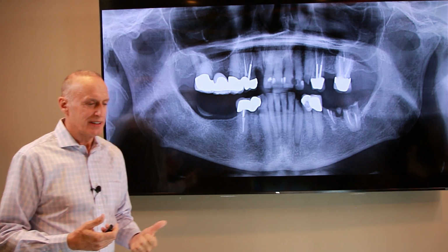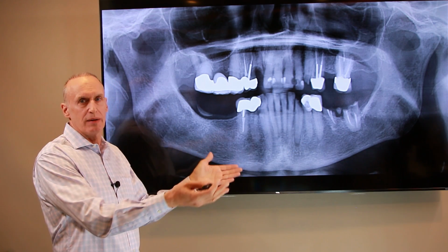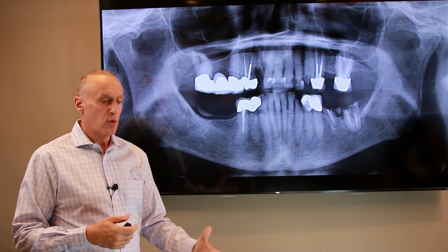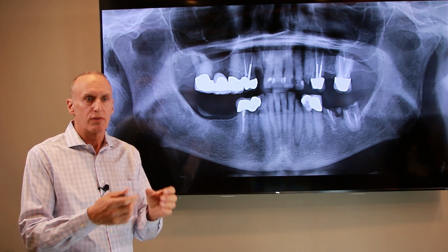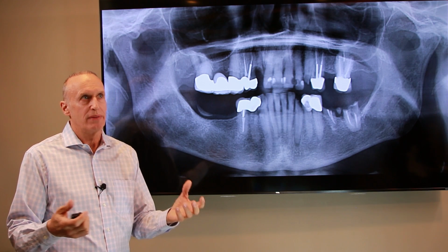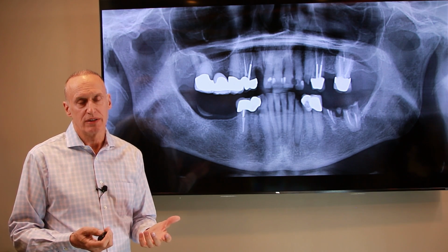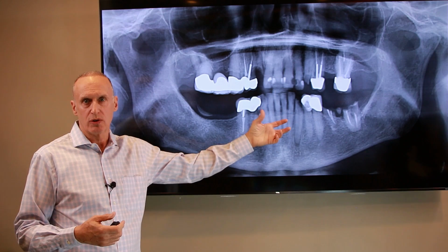My colleagues who do the implant dentures or the All-On-4, first thing they're going to do is take out all the teeth. Then they're going to open your gum tissues up to expose the bone. Then they're going to remove that half an inch of bone everywhere. So even as recently as 4 years ago, I would take all the teeth out, put the implants in, and hope for the best from bone density, implant stability standpoint. Well, I often hit the problem that I have all the teeth out, I have all the implants in, but they're not strong enough to hold a temporary, so then the patient had to go home with dentures for 2.5 months. It was horrible for them, it was disappointing for me, and worse yet, it was hard on the tissues and the bone to wear a denture.